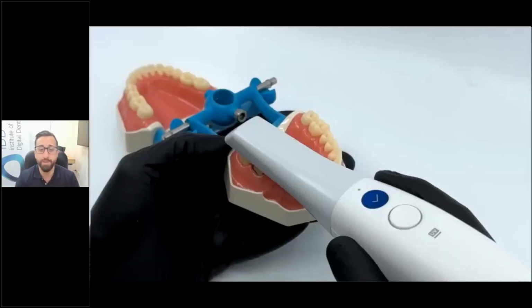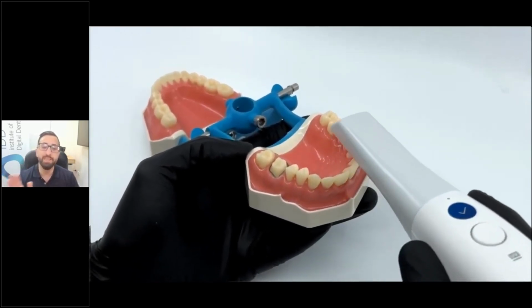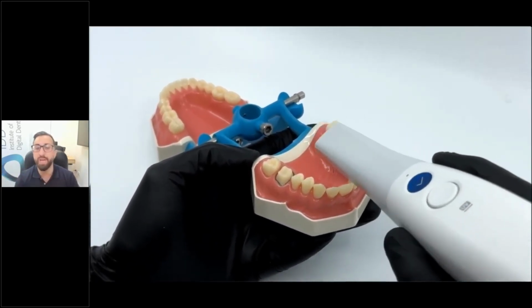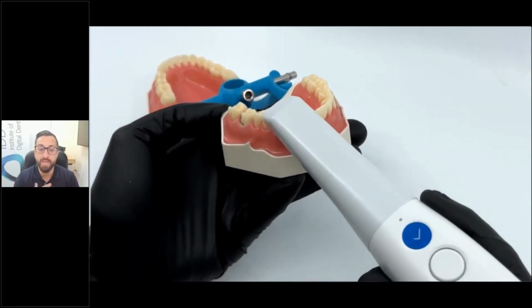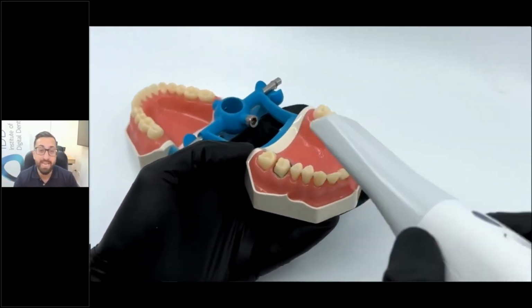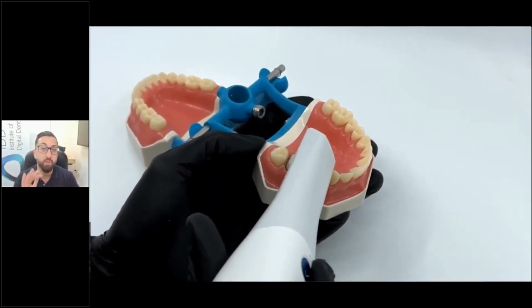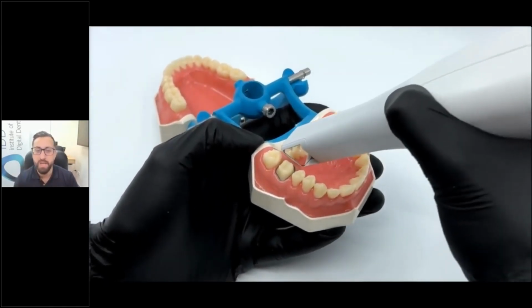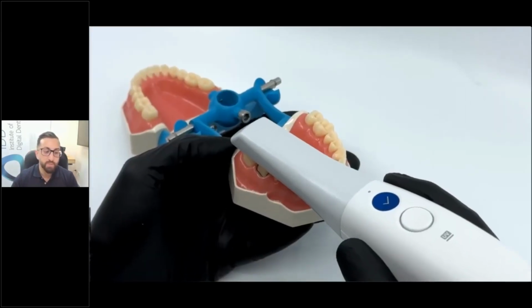Now, I have this short video playing because I don't want to go over scan strategies too much, because everyone's heard about it. But as you can see, the occlusal is scanned first, and then the palatal, and then the buccal, or any variation of this. This basically shows how I do a scan in my office. One key thing that you can see here is how I get the contact points. You can come quite buccal and rotate the scanner to get the contact points, and you can also approach the contact points from the palatal. So I'll just play this once again for you.